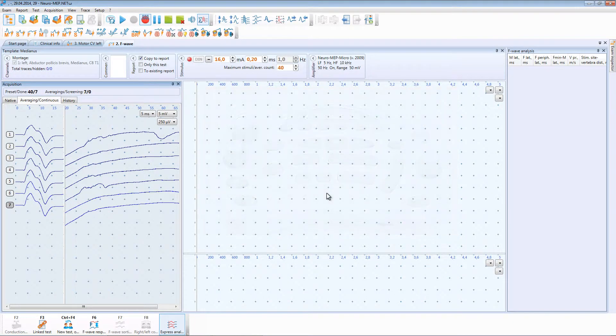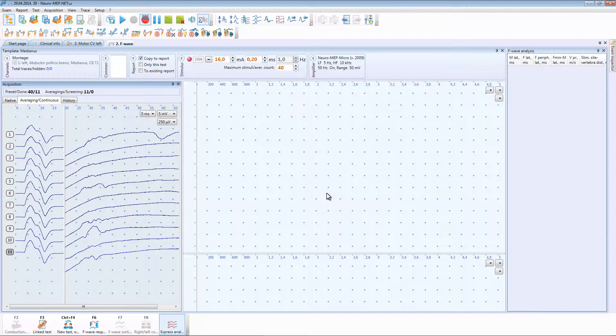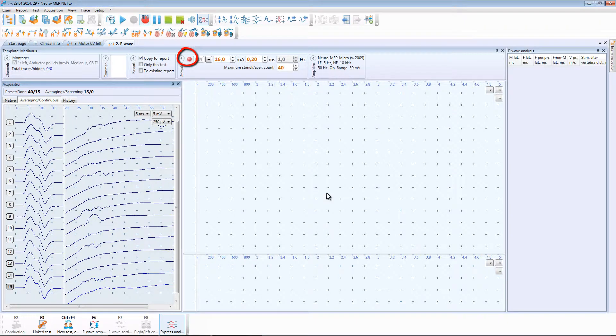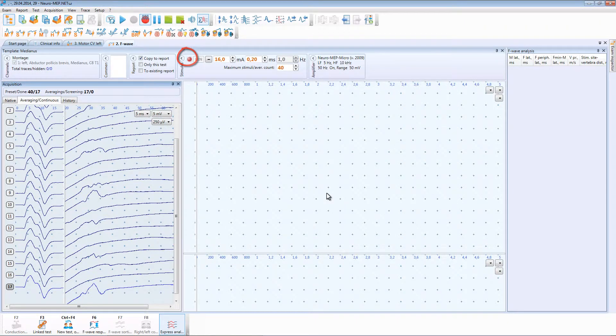Repetitive stimulation with 1Hz frequency and 16 mA stimulation current starts. At the delivery of each stimulus special indicator highlights.